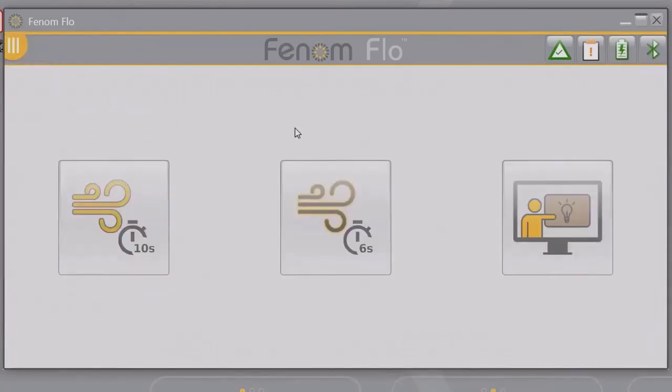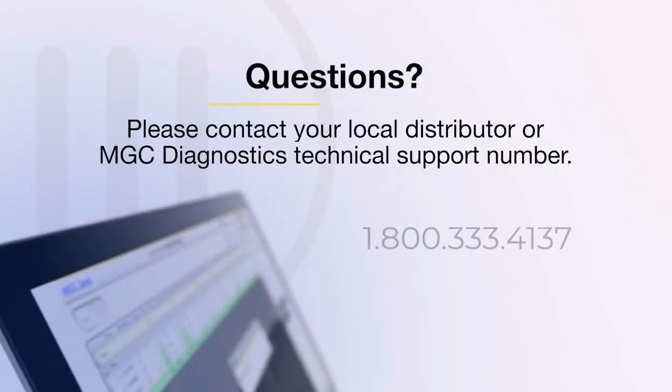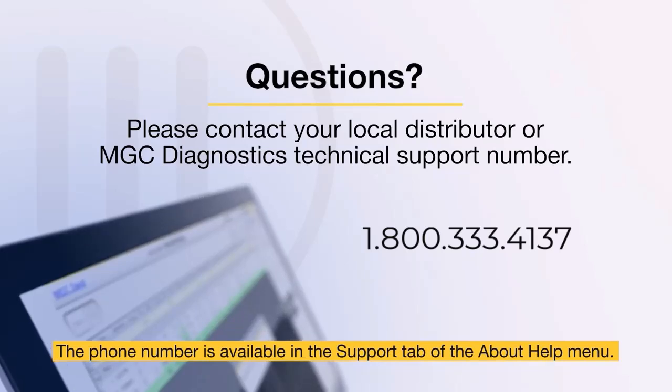To exit the application completely, click on the menu option in the upper left-hand corner of the screen and select Exit. Please contact your local distributor or call the MGC Diagnostics Technical Support phone number, available in the Support tab of the About Help menu.